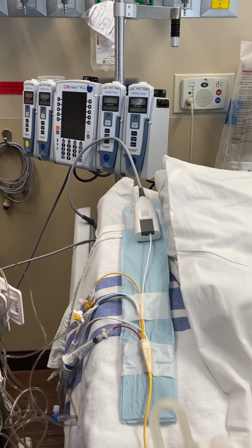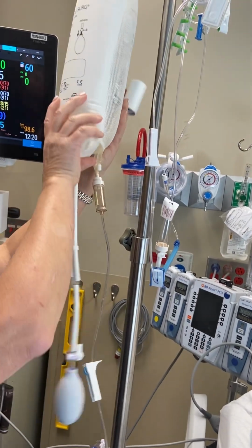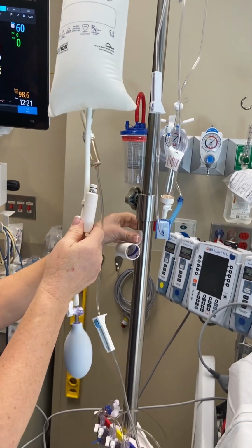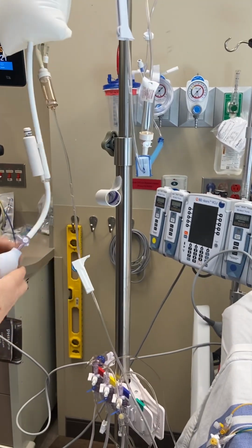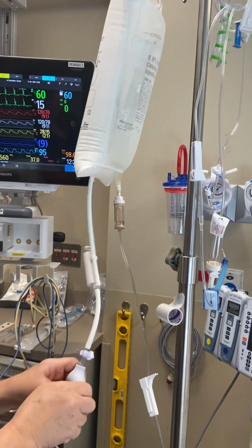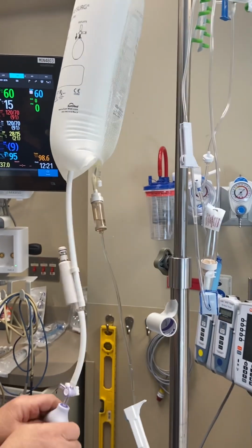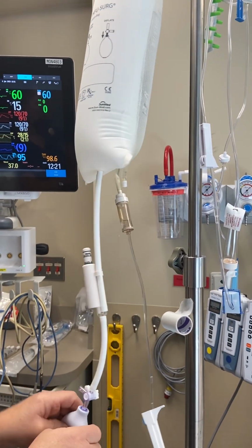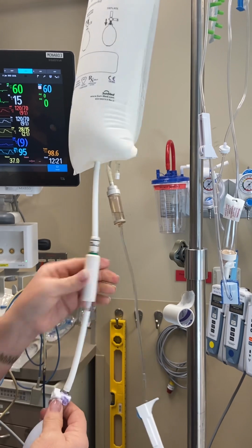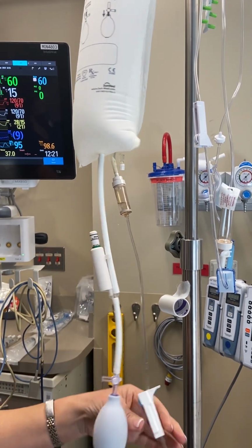Your pressure bag needs to be taken and hung above the patient. Always make sure that your pressure on the bag is pumped up to where you see the little green mark, okay? Sometimes just the movement of the patient from the bed from the OR to the bed, sometimes it gets knocked off or gets undone and some air comes out. So you just make sure that that's a safety thing that you're doing with your assessment, is you're checking to make sure that you can see your little green line on your flush system, okay?